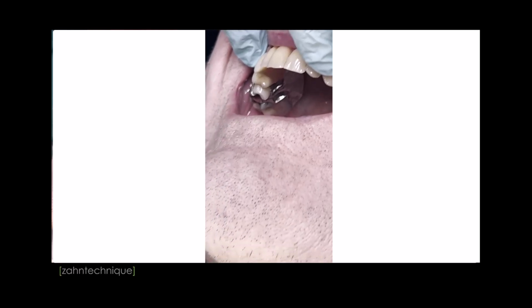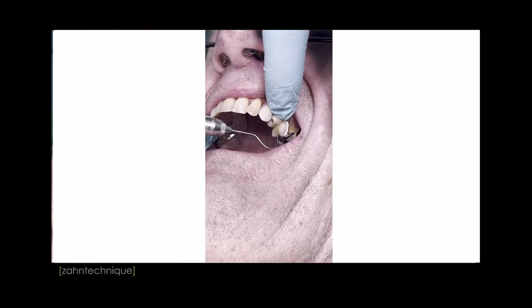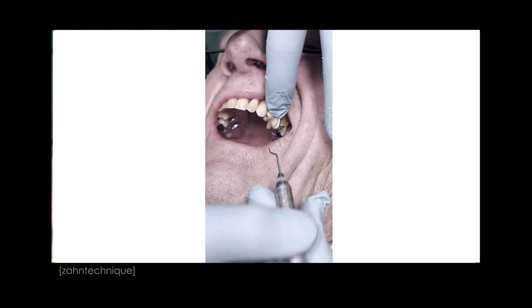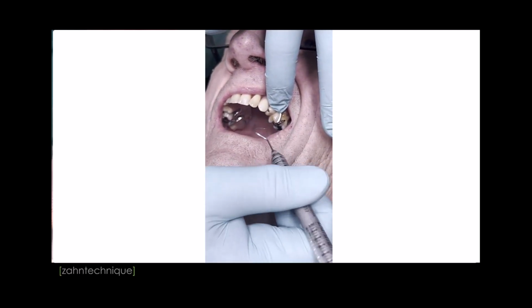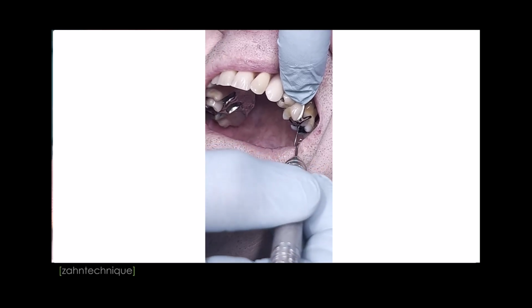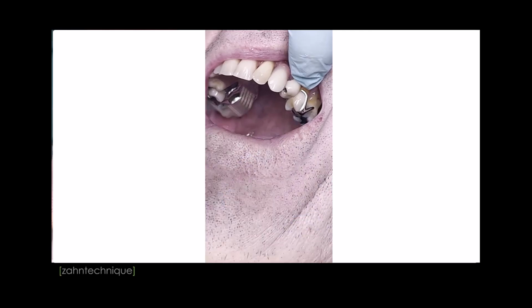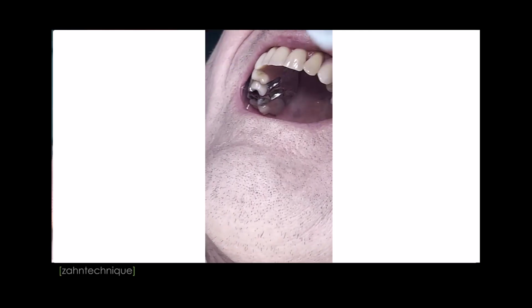But if it's a small strap or in the lower with the lingual bar, usually these fit really, really nice if the scan protocol was really well done, right? So I always recommend if you scan for a partial, scan it, send the scan to the lab and talk to the lab, discuss it. Hey, can you take a quick peek at that scan? Is it possible to do a digital partial?